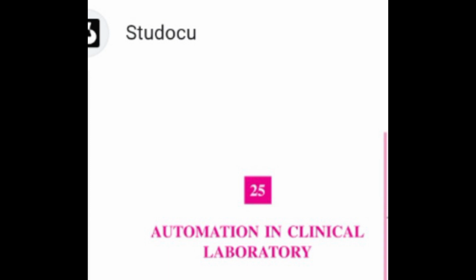The samples are kept in the machine and the computer is programmed to carry out any number of selected tests on individual samples. Types of analyzers: it is very difficult to classify automated systems, even though the manufacturers focus on major processes in each automated system. In order to differentiate one system from another, it is important to know the meaning of terms that are commonly used for auto analyzers.